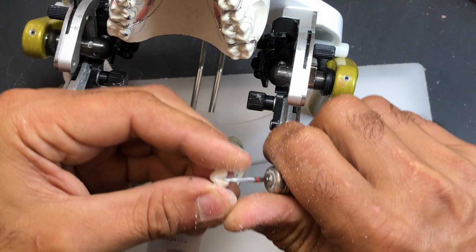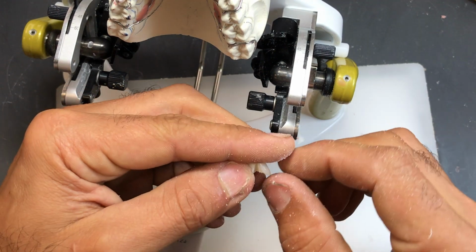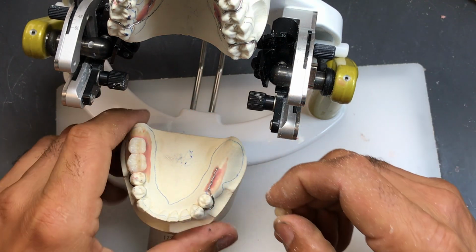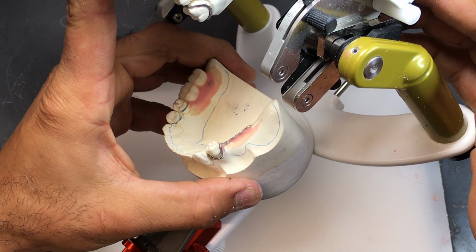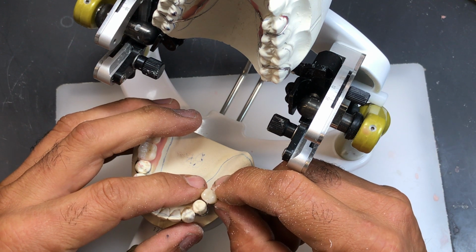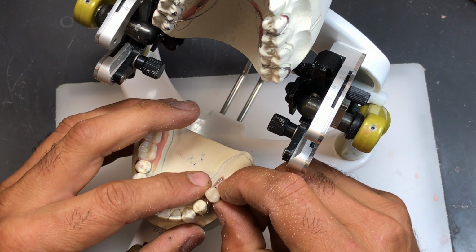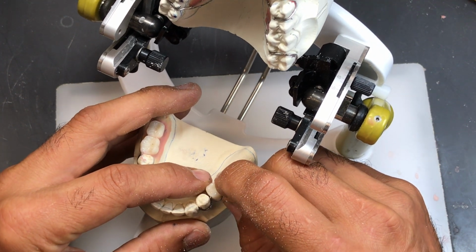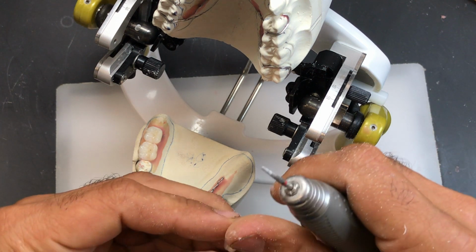I'll open it up a little bit more on the inside. So you can see I've almost cut at an angle, diagonal through the tooth to compensate for the shape of the wire. Let's see if that fits any closer. It does, but you can see the mesial of the 5 does not touch the distal of the 4. So the wire is still in the way. Let's take a closer look to see what else is interfering. It's still the wire. I don't see anything else interfering with it.